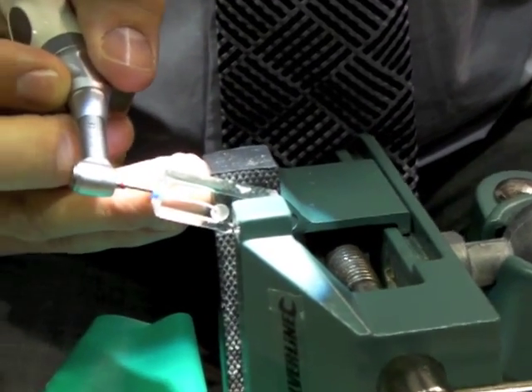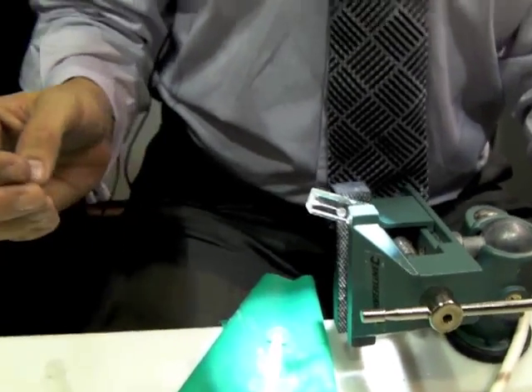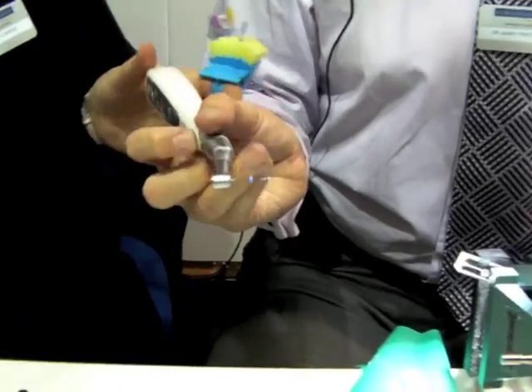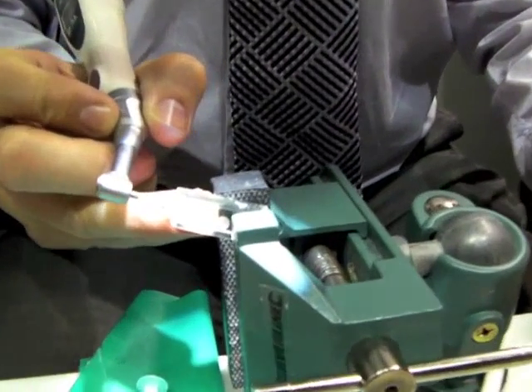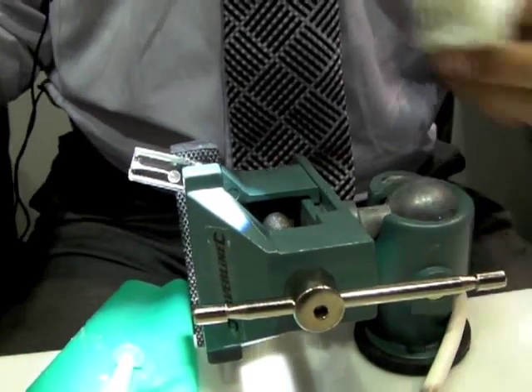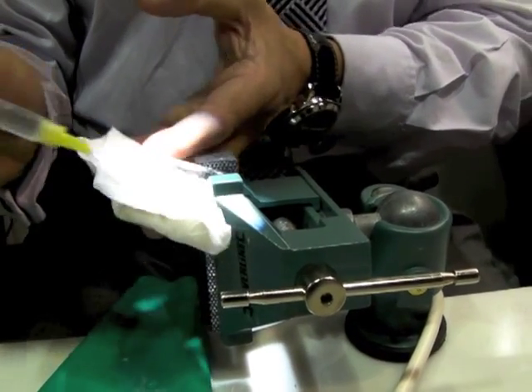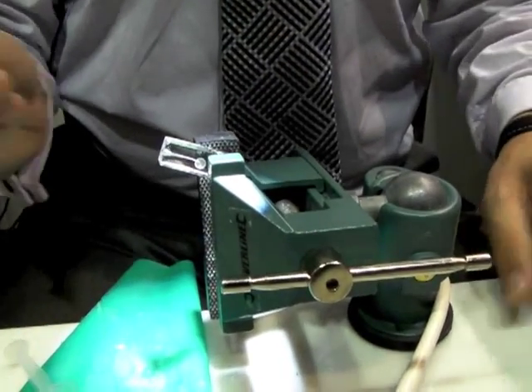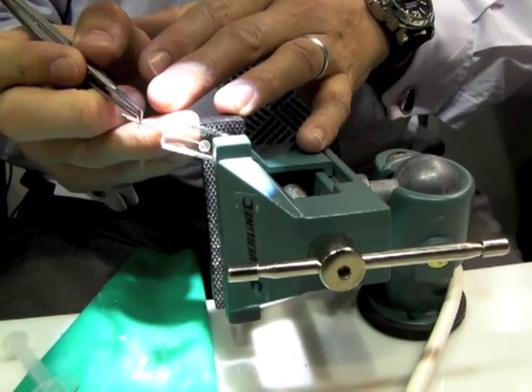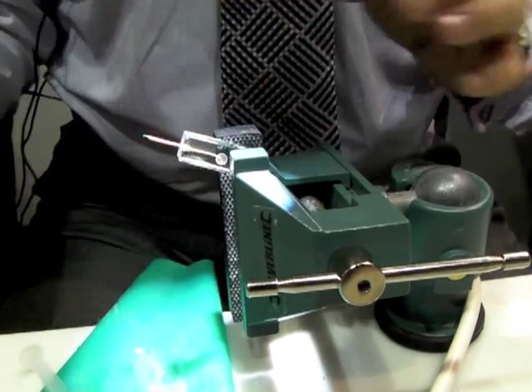Again, a gentle in and out motion until we get to our working length. We then re-irrigate and go to our final instrument, the T3, which is a 3504, and finish that to half a millimetre short of our working length. We then go through a cleaning phase and use a size 3504 GP cone, which we fit to our 0.5mm preparation point ready for obturation.